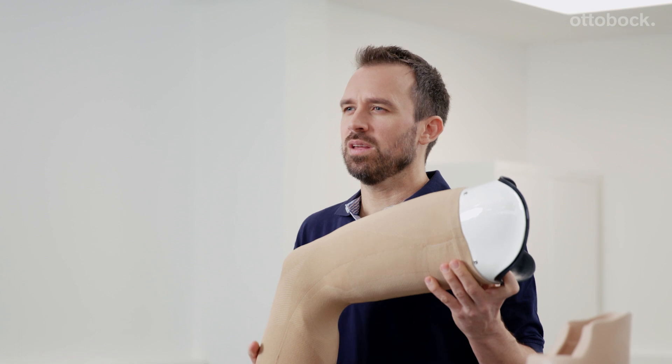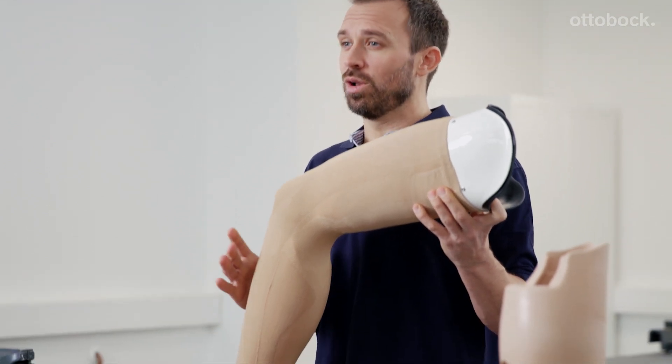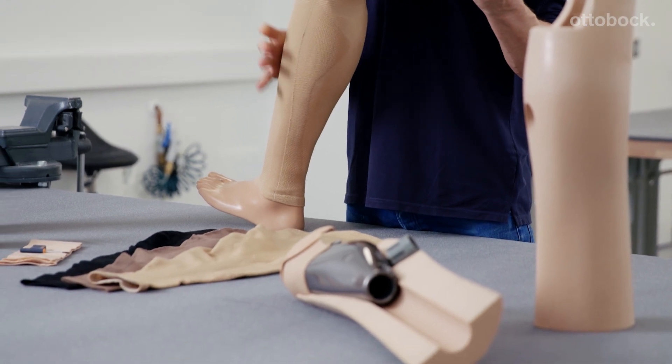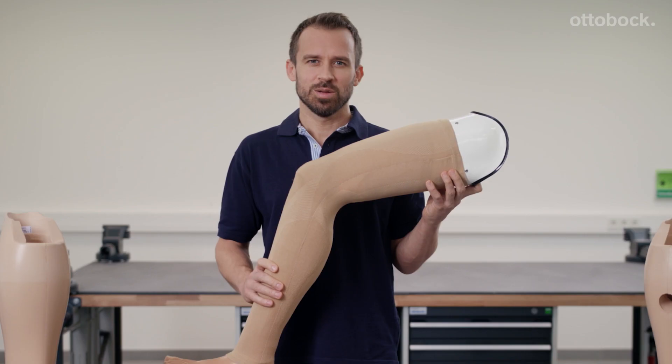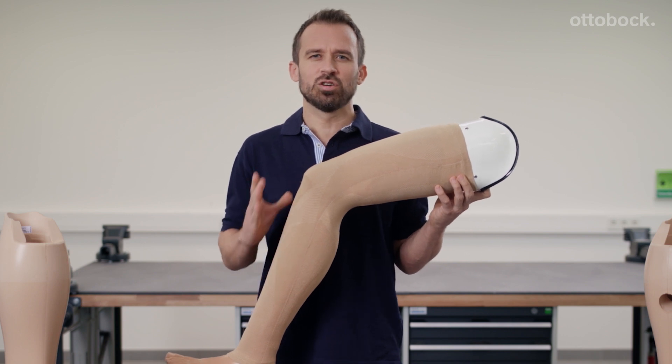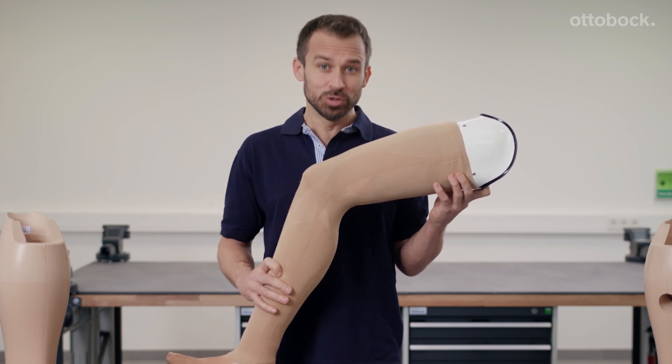That's why I think that what I'm showing you today is a long-awaited innovation in the field of lower limb prosthetics when you consider conventional foam solutions. Because this now means that prosthesis functionality and an attractive look don't have to be mutually exclusive.